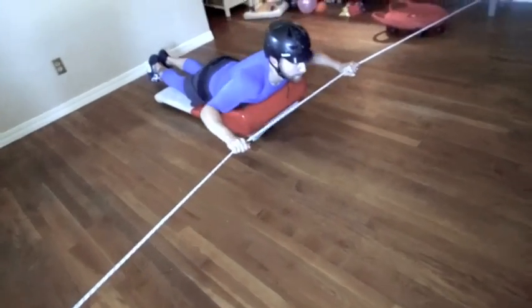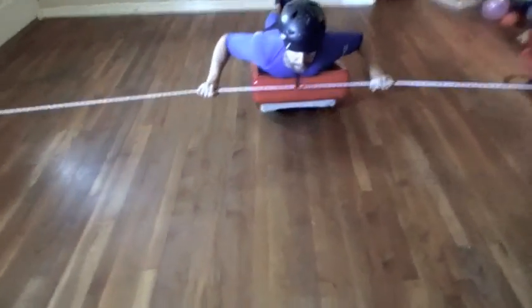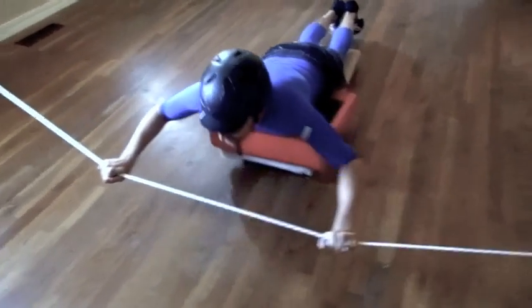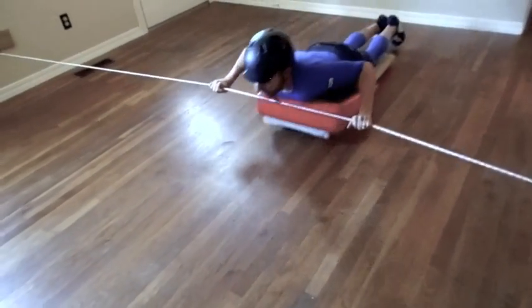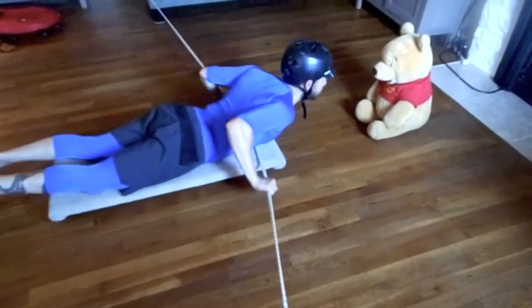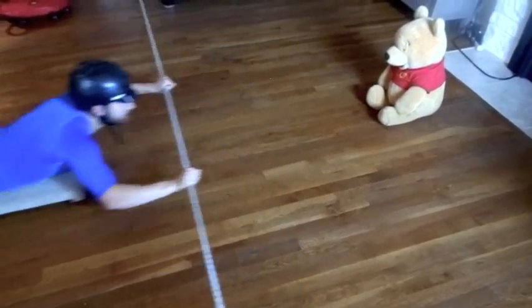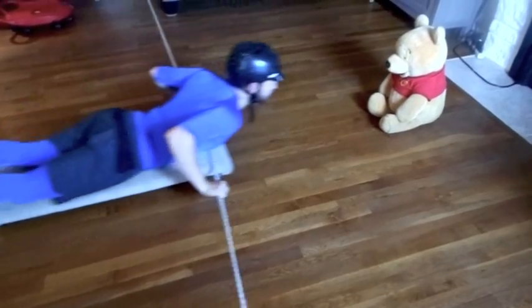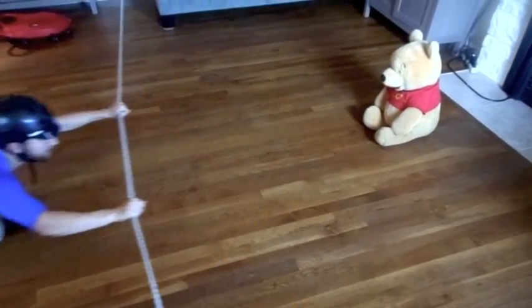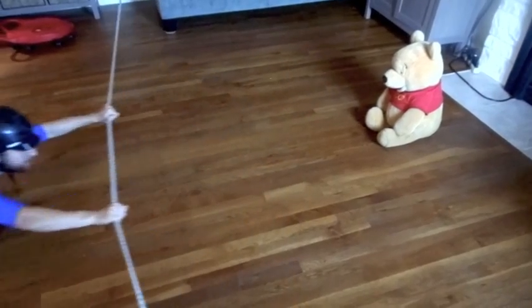The addition of the wedge helps with keeping the bungee away from the face and allows the child freedom of motion. To help keep kids engaged in the prone position, using their favorite stuffed animal or toy will help to motivate and continue the exercise. This is key in keeping kids engaged and motivated in a challenging position.